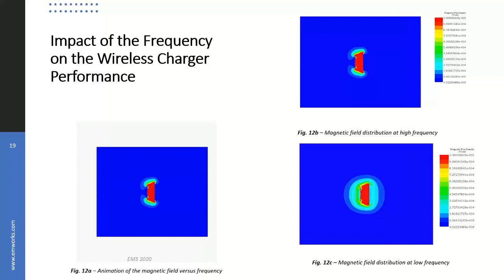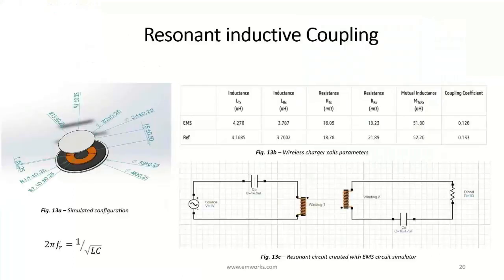So from these figures, it can be seen that the magnetic field is much more concentrated and directed to the receiver coil when the frequency is high. Another way to improve the efficiency of an inductive coupling system is by using a resonant circuit. This technique allows us to increase the transmitted energy even when the coupling is weak.